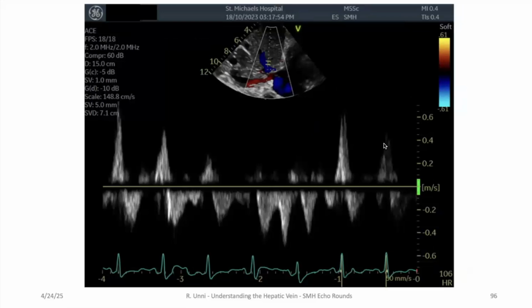And now when we pulse our hepatic vein, we can see, okay, there is some variation. If we do that kind of exercise as we did, we draw a line on a QRS structure that we recognize. We can see that we have an initial negative deflection, that's our S wave. Then we have our D, A, S, D, and then we have this increased reversal.